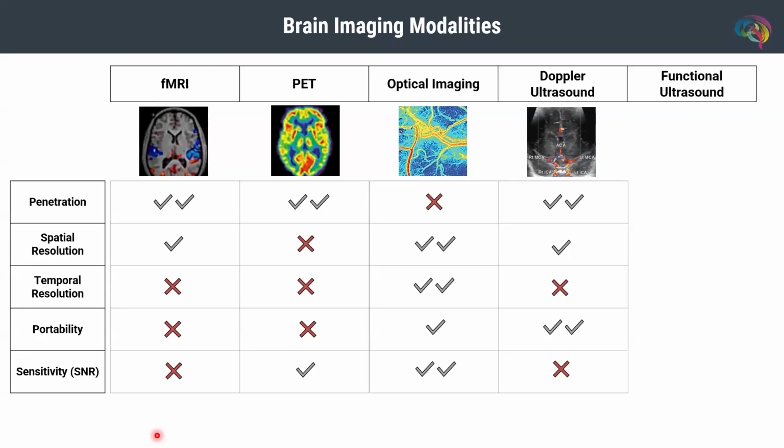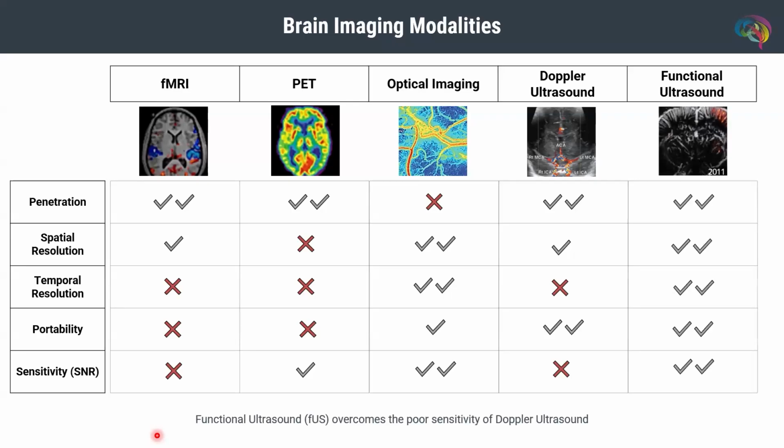And that is why functional ultrasound, ultra-fast functional ultrasound, was developed to overcome these limitations for more widespread use.